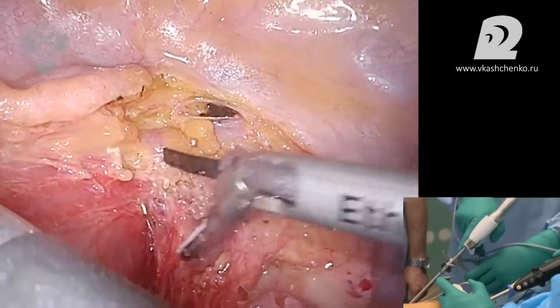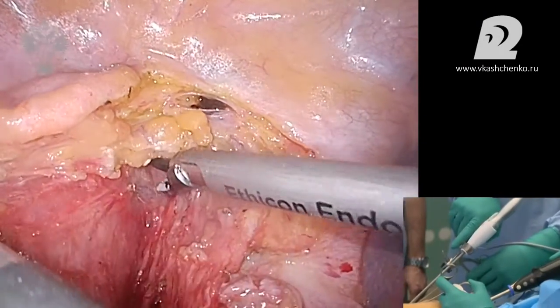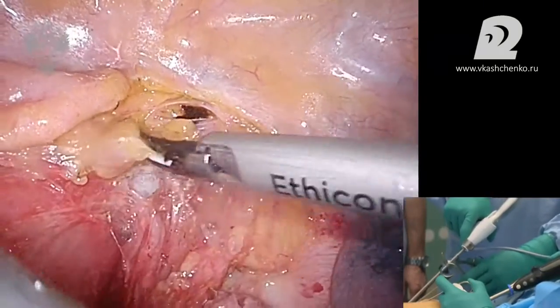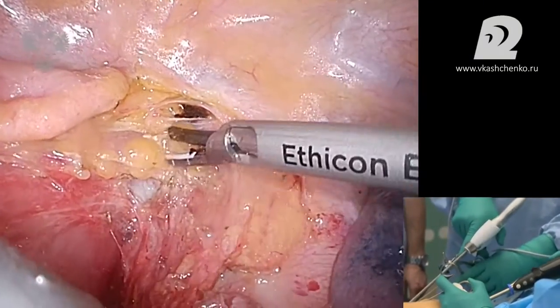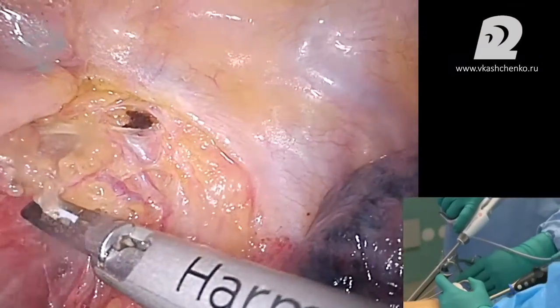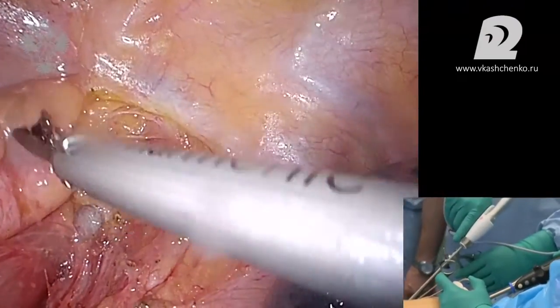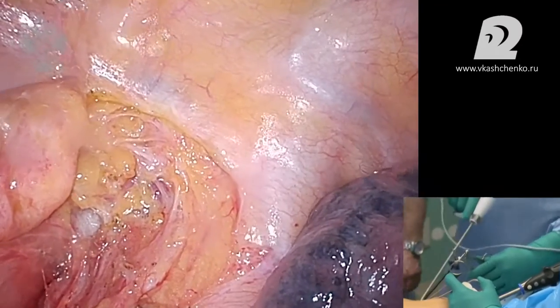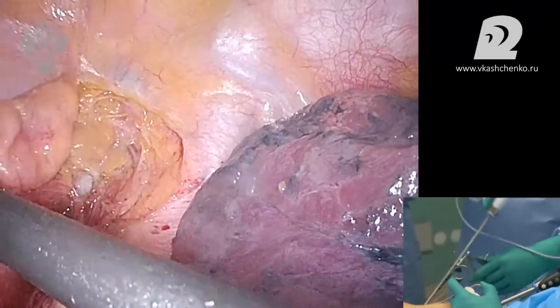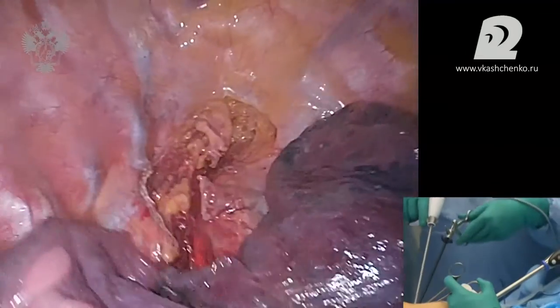To the right is trachea, to the left it's esophagus. The zone where the esophagus is intact, there are no problems with the walls. You can see a ray of light here from time to time. It's the highest paratracheal node. And taking it away, a lower one, and a little bit of deposit of carbon. That's what we saw.